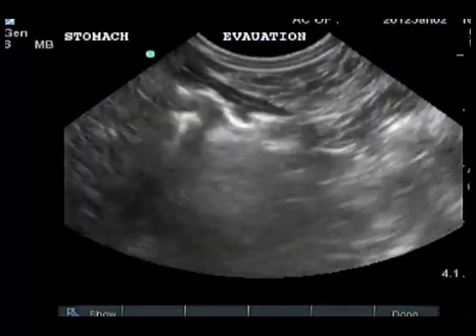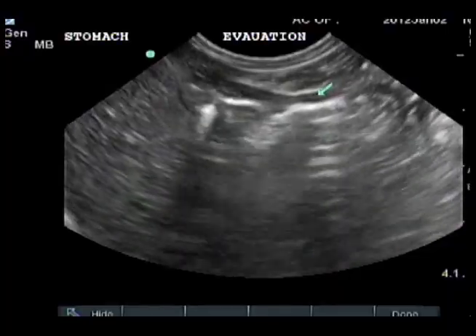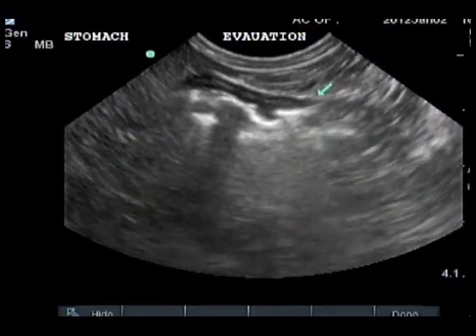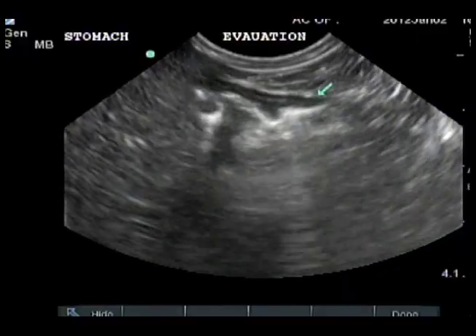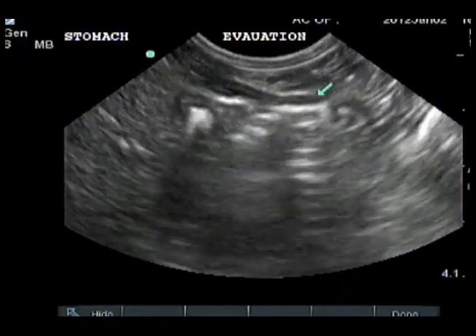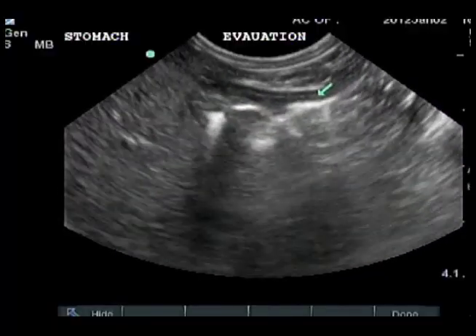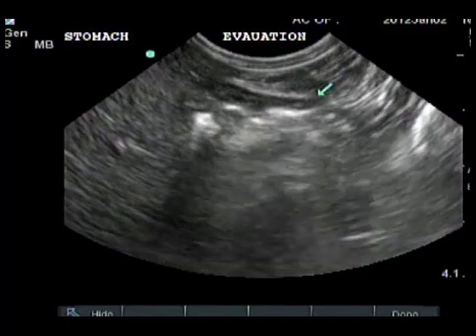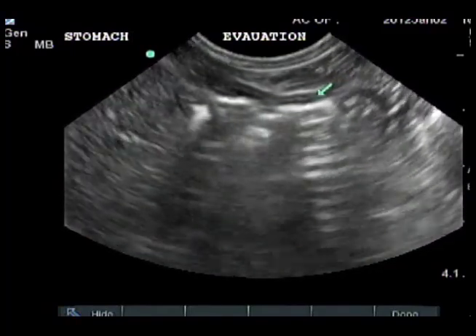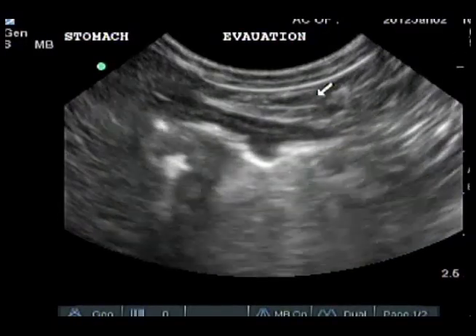The stomach wall is usually evenly thickened between rugal folds. In live two-dimensional ultrasound, the stomach contracts about 5 times a minute or once every 12 seconds. If the patient has not been fed in 12 hours, the stomach is expected to be empty. Dogs often swallow air, and even an empty stomach may have a lot of gas artifact.